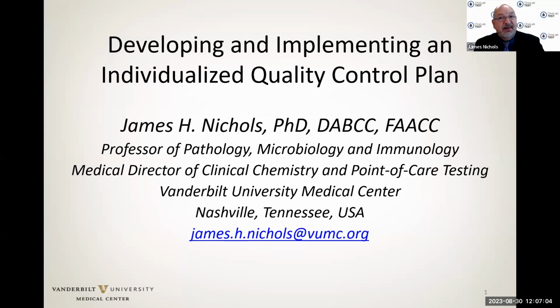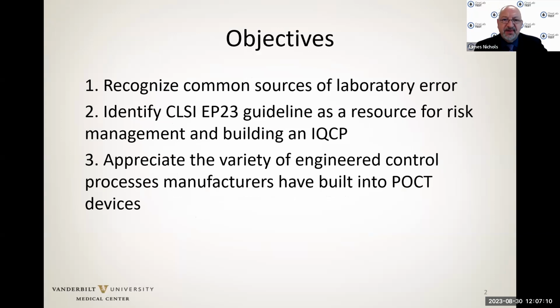So I'm going to be discussing developing and implementing an individualized quality control plan. The objectives today are to recognize common sources of laboratory error, identify the CLSI, that's Clinical Laboratory Standards Institute, Evaluation Protocol number 23 or EP23 guideline as a resource for risk management and building an IQCP. That's an individualized quality control plan.